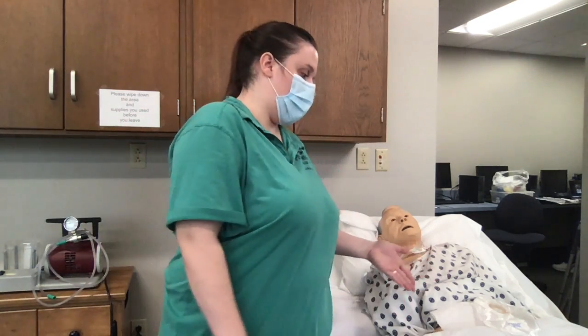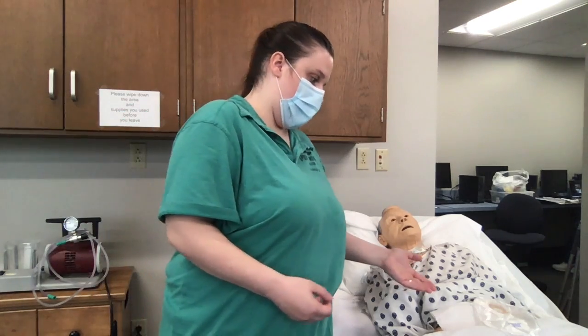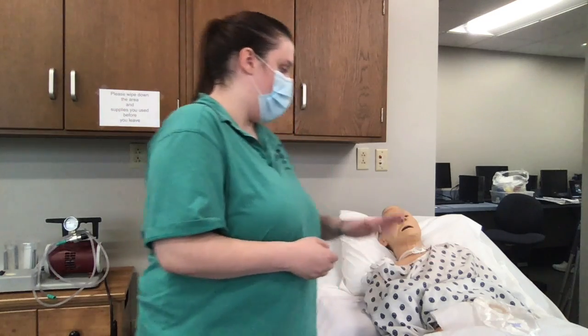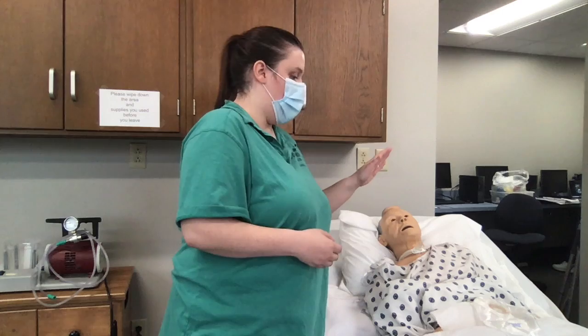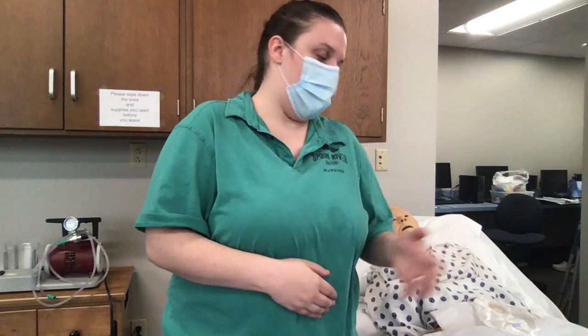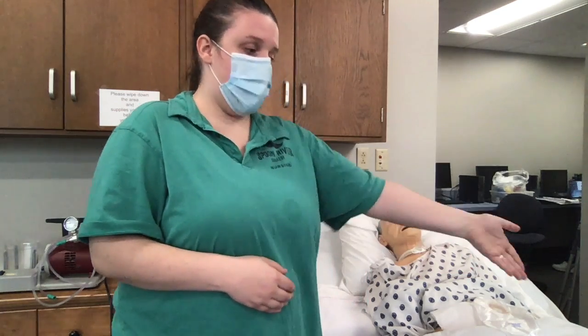If I were to be irrigating them on the toilet, I would irrigate, and then I would bring them back and measure my wafer, cut it, reapply, and reapply my bag. And then I would put on clean procedure gloves, which I obviously forgot to do. So I put on clean procedure gloves before doing all of this, and then when I'm all done, I'm going to place the patient back in a comfortable position. I'm going to take off my procedure gloves, perform hand hygiene, place the patient at the lowest level, and their call light within reach, and I'm going to dispose of the contents of my bedpan per agency policy.